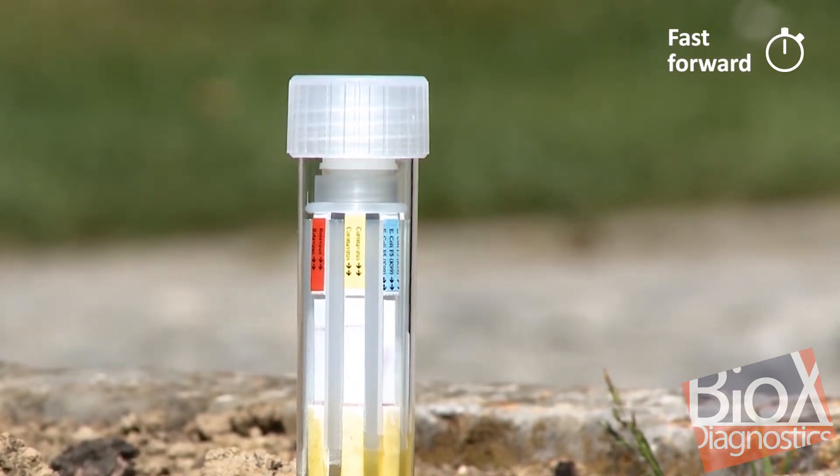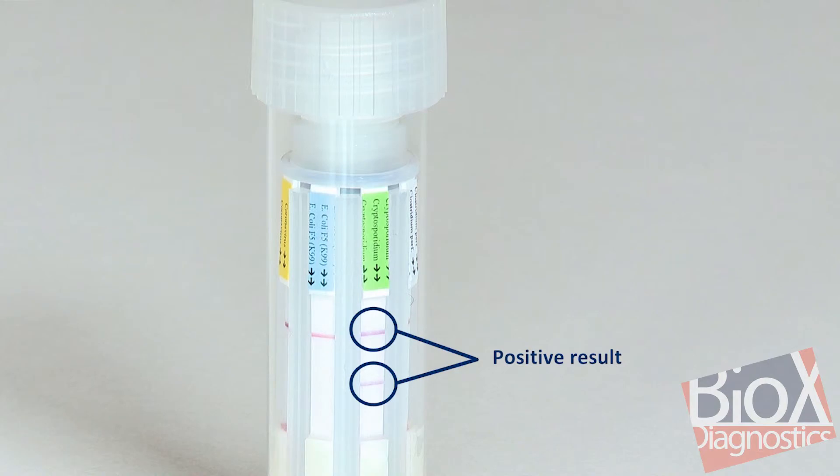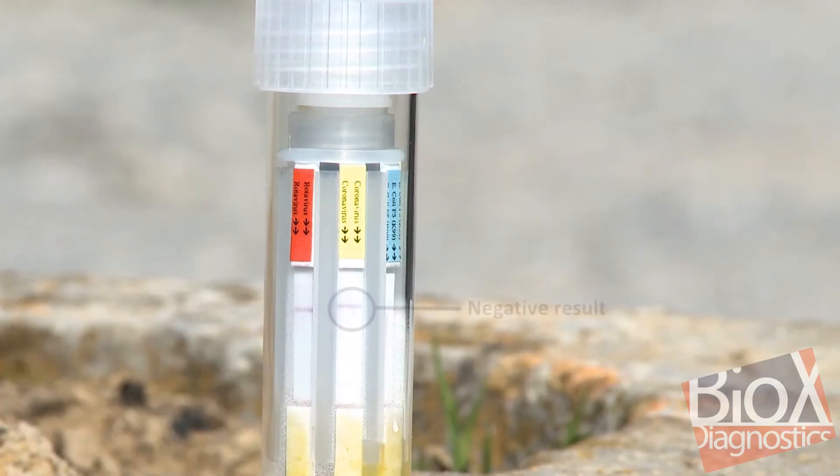Once the 10 minutes have elapsed, read and interpret the results. Two lines on a strip correspond to a positive result, and a single line in the upper position corresponds to a negative result.